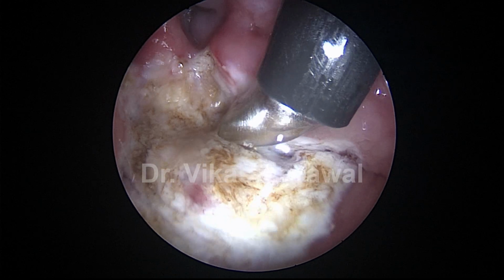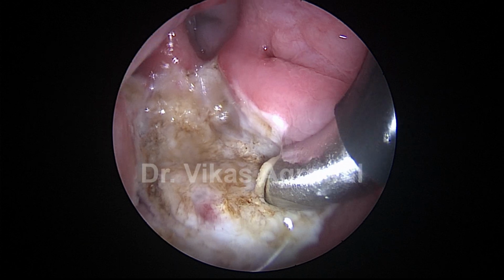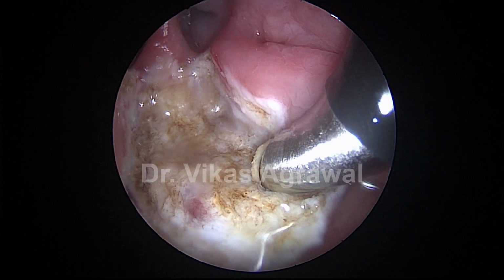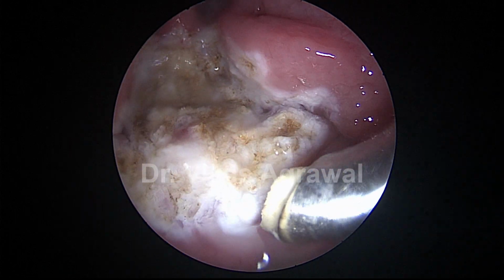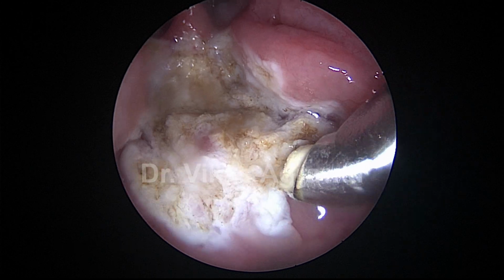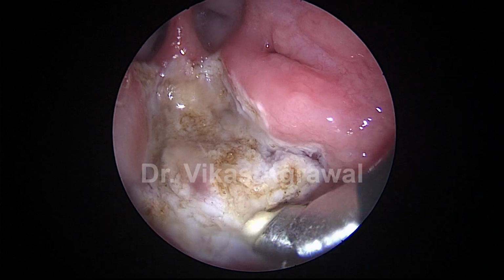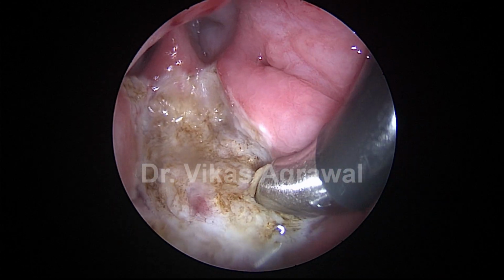So this is the advantage of this route, that you can remove tissues behind the Torus tubarius, which is not so easy when you do the surgery from the nasal side, because then the Torus tubarius does not let you see behind it. The disadvantage is that you do not see the buccopharyngeal fascia so nicely from this view as you see from the nasal side.